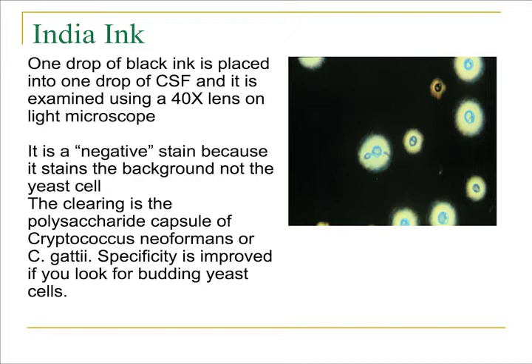You put 1 drop of black ink, literally it's like pen ink, so-called India ink, and it's placed on a microscope slide, and then you also put 1 drop of your CSF specimen, and then you observe it under a 40x microscope lens, a light microscope.